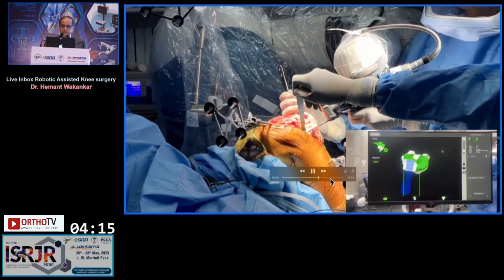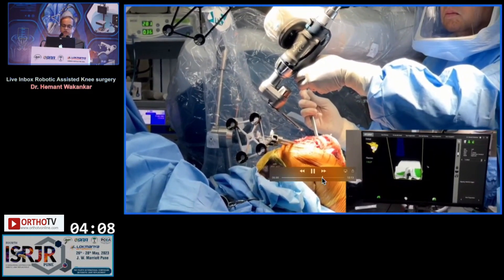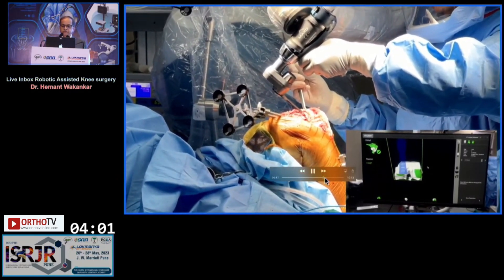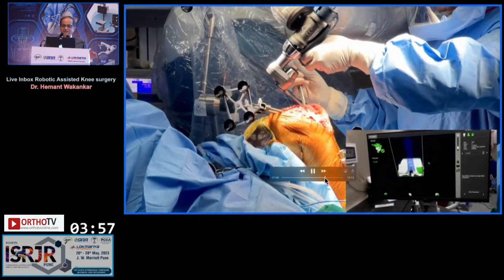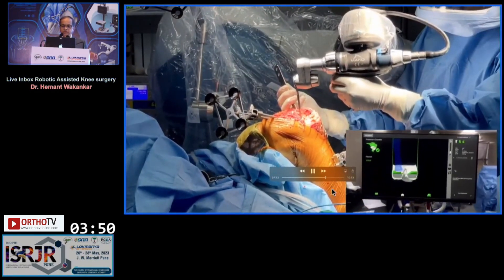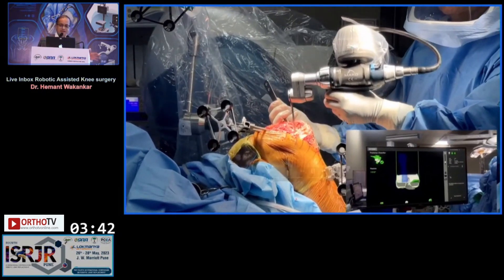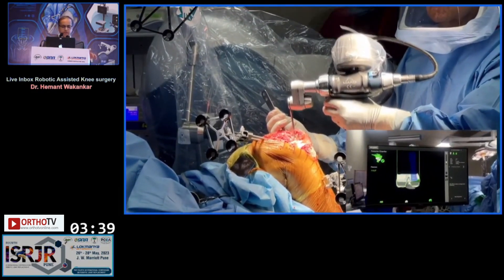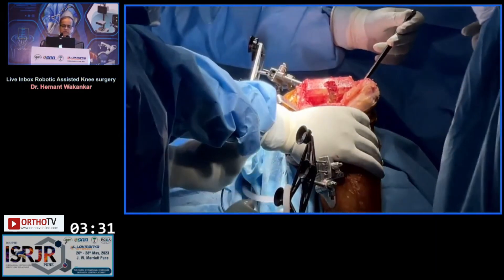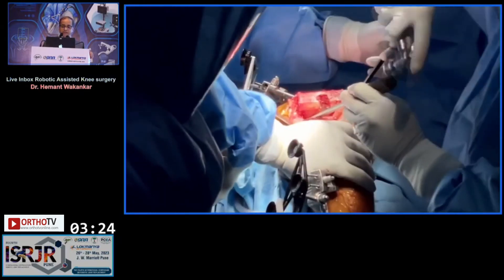At the end of all these bony resections, next is the distal femoral cut — just a different attachment for the saw — and the posterior chamfer. This is the distal femur cut on the lateral side, and next is the posterior chamfer, again with just pushing using fingers with hardly any pressure. After all the bony resections are done, all that remains is excision of posterior osteophytes if any, clearing, and putting the trial components on. In this case there was no hyperextension, so I excised all the posterior osteophytes but did not do any soft tissue releases posteriorly.